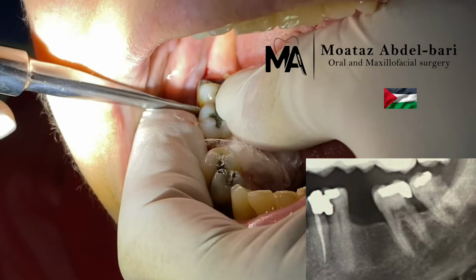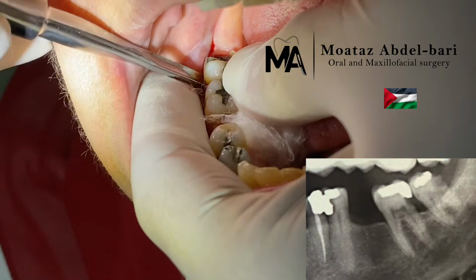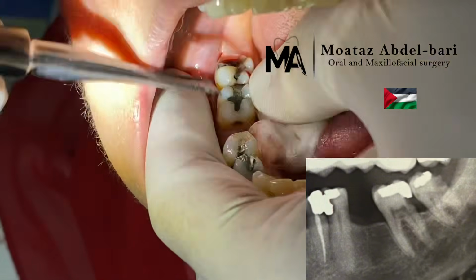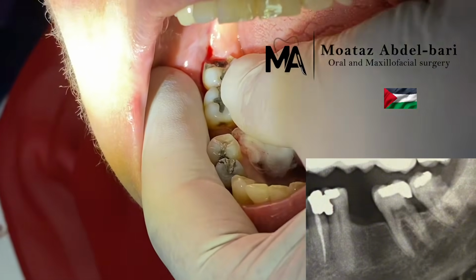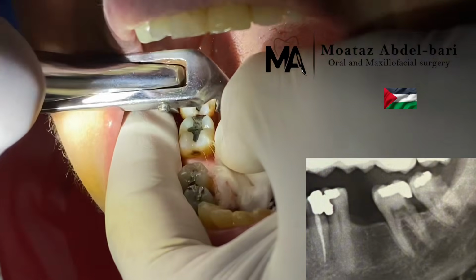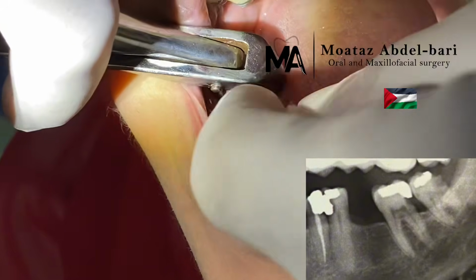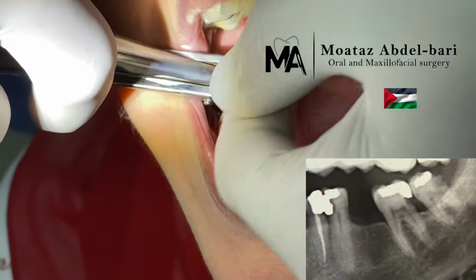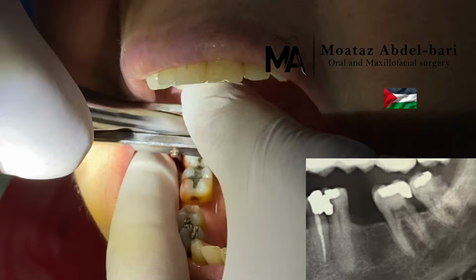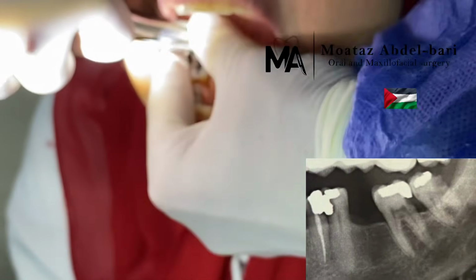It sustains more occlusal force, with intimate contact between the bone and the root, which means it will be very difficult in luxation. Also resorption of mesial interdental bone, mesial to lower 8, which means I lost the fulcrum for the lever. For this reason I decide on forceps extraction, but it's very difficult due to accessibility, due to upper 8 eruption coupled with limited jaw opening of the patient.